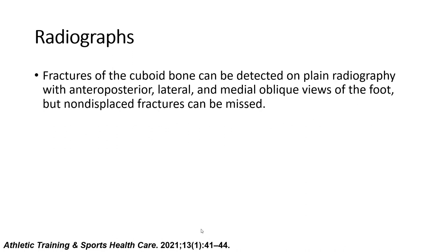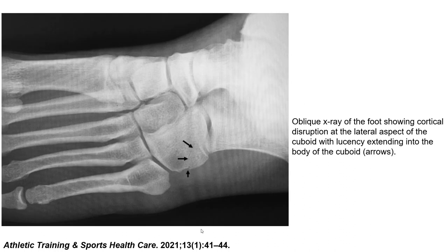On radiograph, fracture of the cuboid bone can be detected on plain radiography with anteroposterior, lateral, and medial oblique views of the foot, but non-displaced fractures can be missed. This is an example of the cuboid fracture on the oblique x-ray of the foot, showing cortical disruption at the lateral aspect of the cuboid, with lucency extending into the body of the cuboid and minimal shortening of the cuboid.